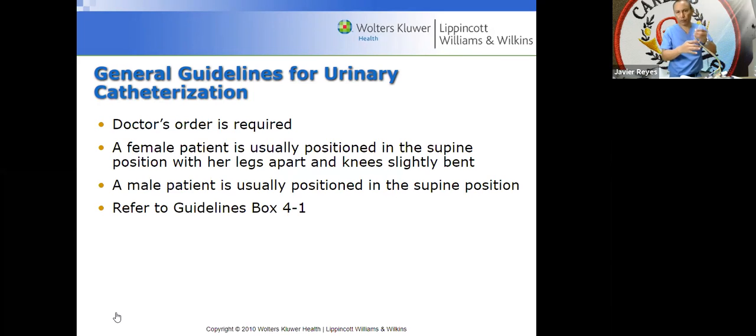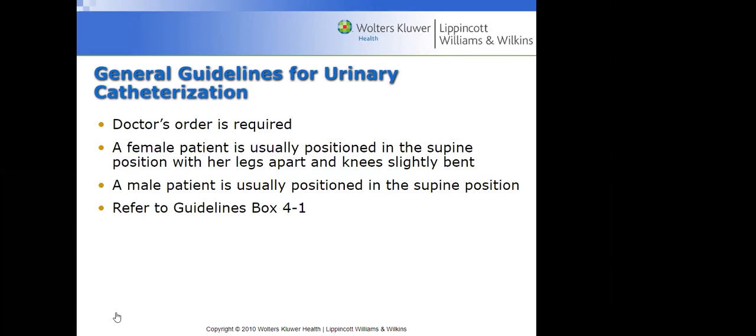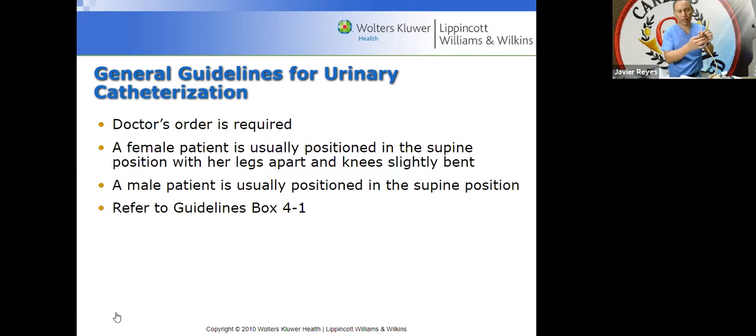Now, you don't want to go too far in. Why? Because you might actually go up into the ureters, okay? The ones that bring the urine from the kidneys. You don't want to go in there because you might inflate the balloon up there and you might cause trauma to the ureters, okay? So you got to be careful.